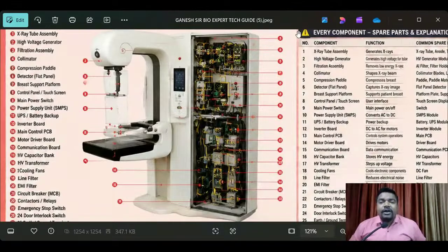Right, now come to the point. I hope you got it, what are the level parts inside the equipment, for your knowledge purpose. These are the points you have to learn and you have to practice. My advice is, before touching any medical equipment, you have to read the manual. Every equipment: minor equipment, major equipment, critical equipment, non-critical equipment, radiology equipment. Any equipment, take half an hour and read all things. What are the specifications? What are the electrical fluctuations? What are the limitations? And what is the troubleshooting? Everything is available there.